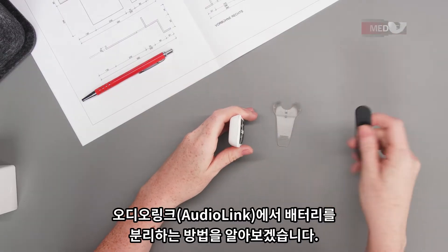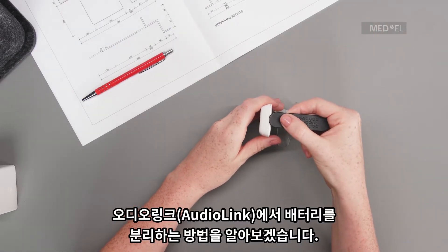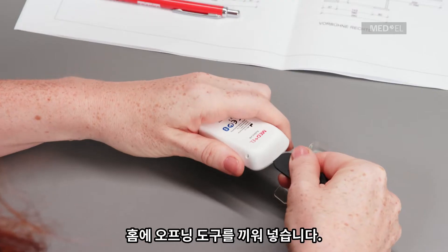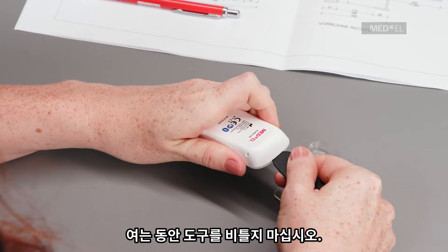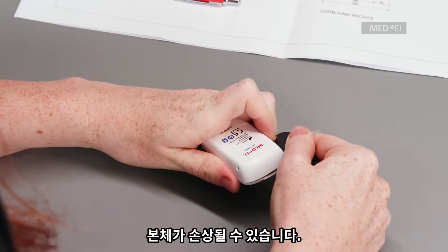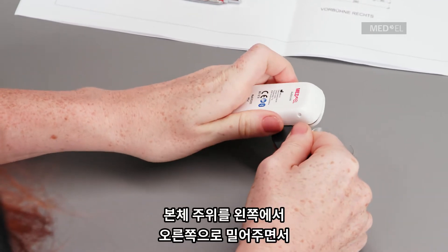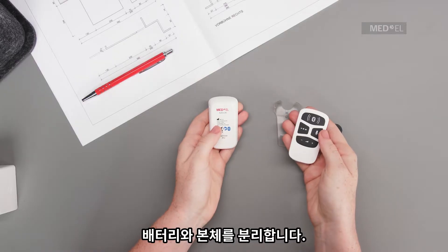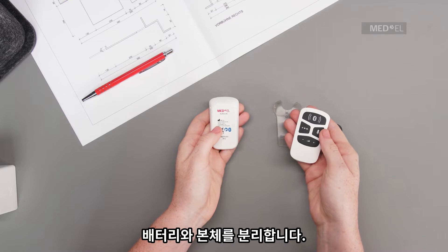To disassemble AudioLink, remove it from the docking station. Insert the opening tool into the groove and do not twist the tool while opening AudioLink, as this could damage the housing. Slide it around AudioLink from left to right until the main unit and the battery unit detach from each other.